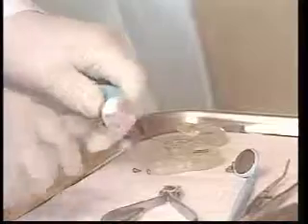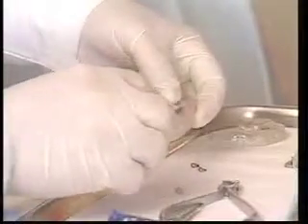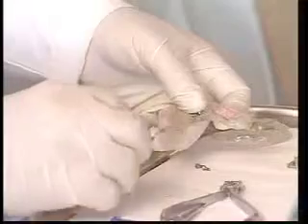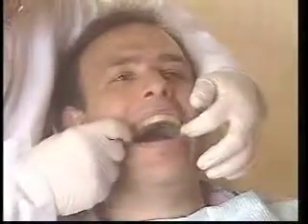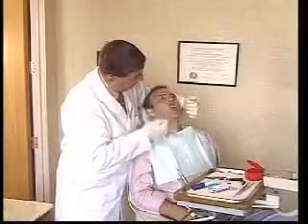If the contact is not correct, adjust it with acrylic burrs and repolish. If necessary, grind in the bite pads using milling paste to achieve an absolute balance. Bite. Forward and backward.